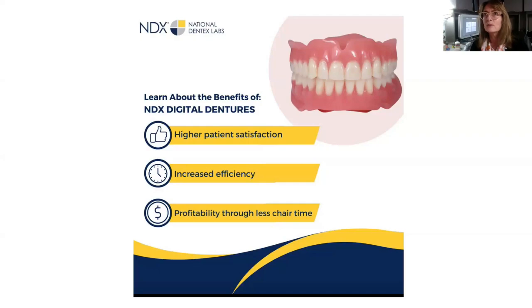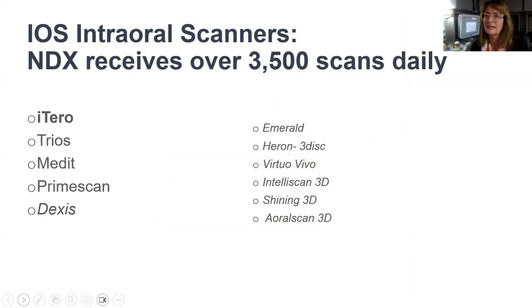Increased efficiency. I will say that once you become a proficient user, your time is more efficient versus a physical impression. But it's not going to be the first time you do an intraoral scan of that fully edentulous patient. And then profitability through less chair time. Again, it's very dependent on your proficiency with the techniques in general, your comfort level, and how quickly you get up to speed.